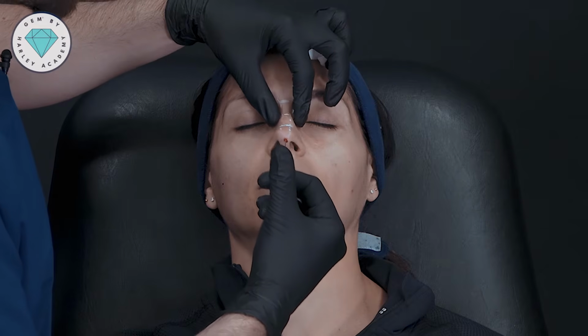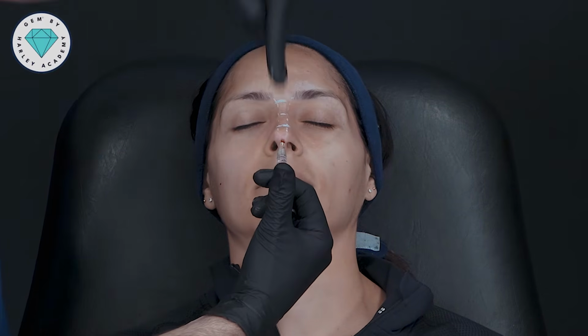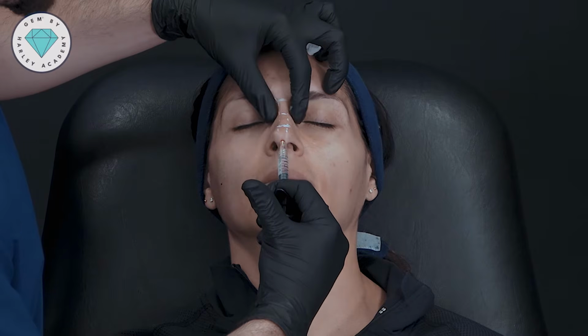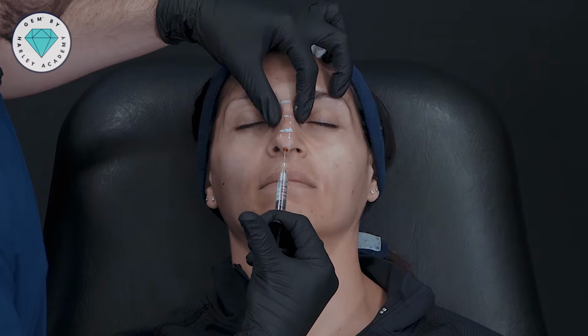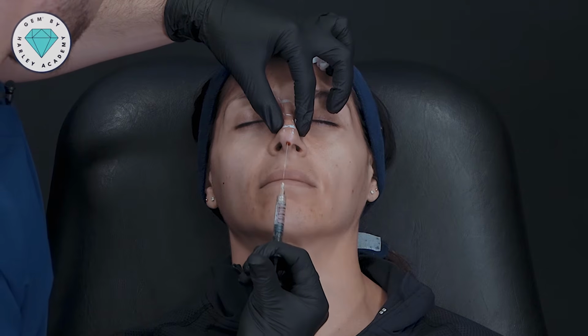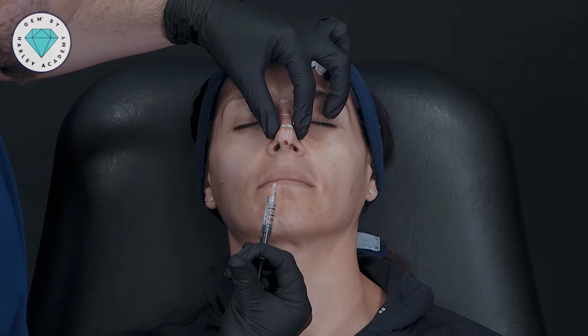As I come out, I'm going to create a strip of filler all the way down the dorsum of the nose to really help create that light reflex that will look really aesthetic on camera or in photos, or just as the light bounces off the nose. A little bit of definition at the tip of the nose here. Well, okay. Let's take a look.